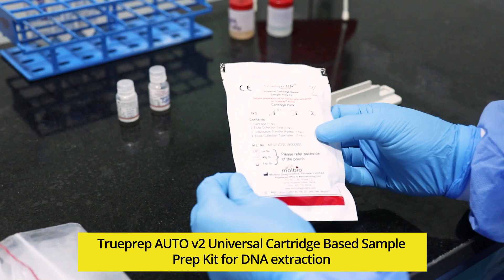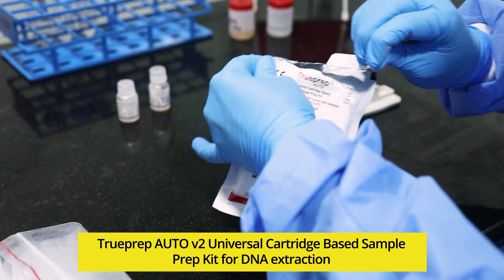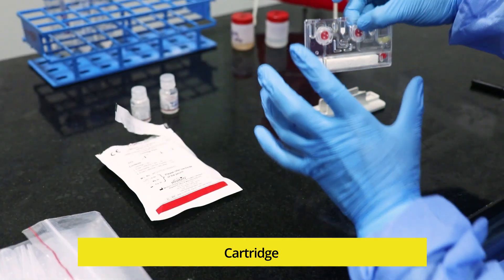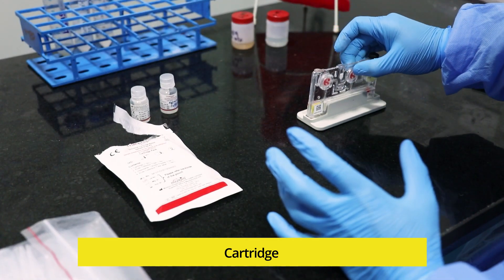Take out the cartridge pouch from the TruePrep Auto V2 universal cartridge-based sample prep kit. Open the cartridge pouch gently, take out the cartridge and place it on the cartridge stand.